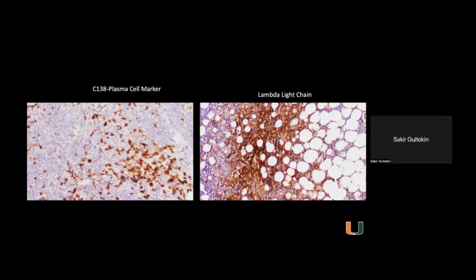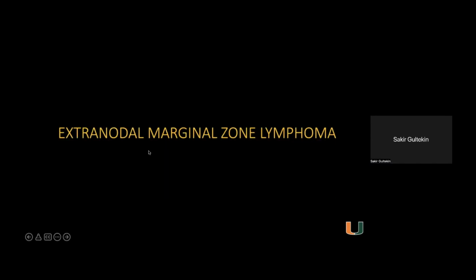So it looks like a low-grade lymphoma, and this is becoming a subspecialty issue now. We sent it to hematopathology, and they classified it as an extranodal marginal zone lymphoma. The patient is immunosuppressed. Definitely, they can develop lymphoma.